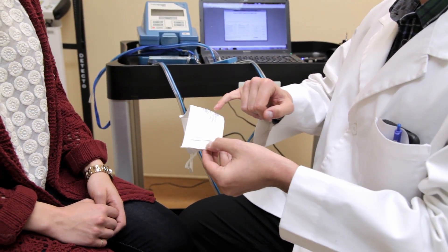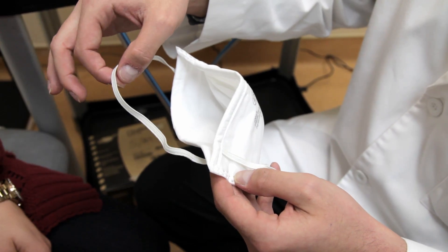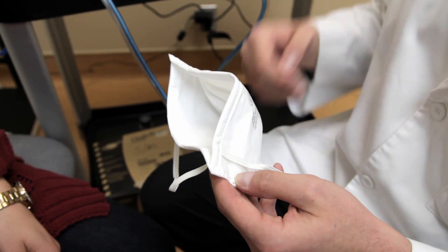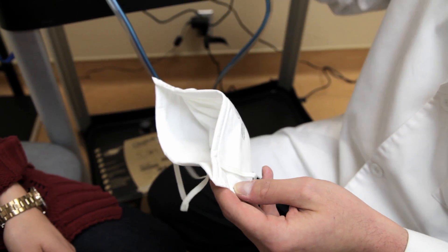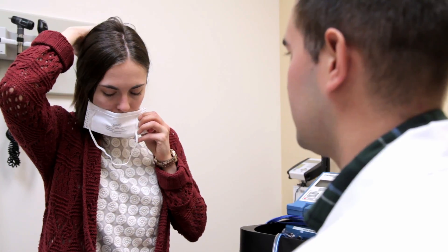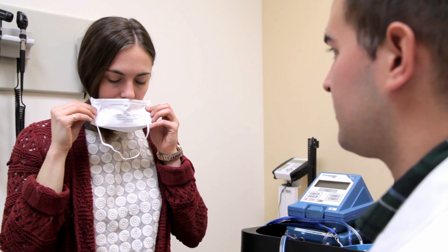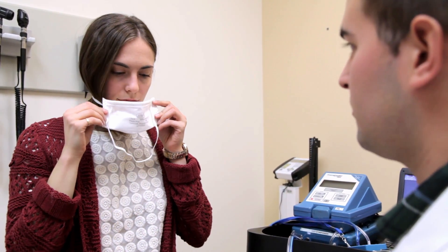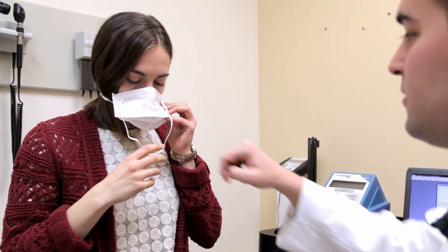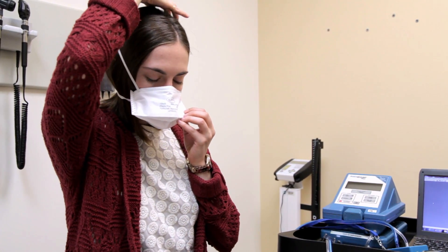There are two different types of mask fit testing methods: qualitative and quantitative. Qualitative mask fit testing is generally unreliable due to a number of subjective factors and does not ensure proper protection. Quantitative mask fit testing relies on particle analysis to ensure mask integrity and performance. Intrinsic Analytics only offers quantitative mask fit testing.